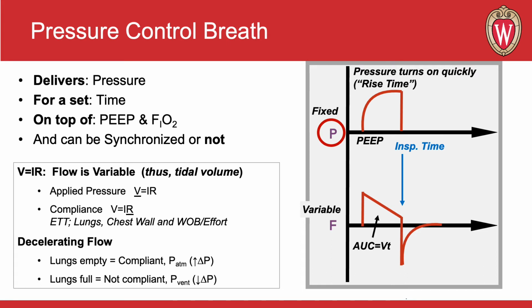Now again, V equals IR drives all of these conversations. And in this case, when the pressure is fixed, the V is fixed, and the flow is variable. And so is the tidal volume. You can change that flow by changing the pressure or by changing the compliance.